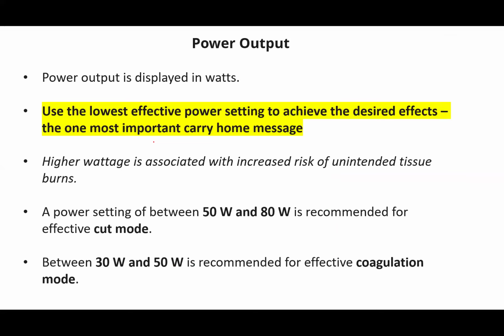Now, we've mentioned one of our important opening statements that you should never forget. Use the minimum energy output to get your desired effect. Power output is displayed in watts. Use the lowest effective power setting to achieve the desired effect. The most important take-home message for this lecture.